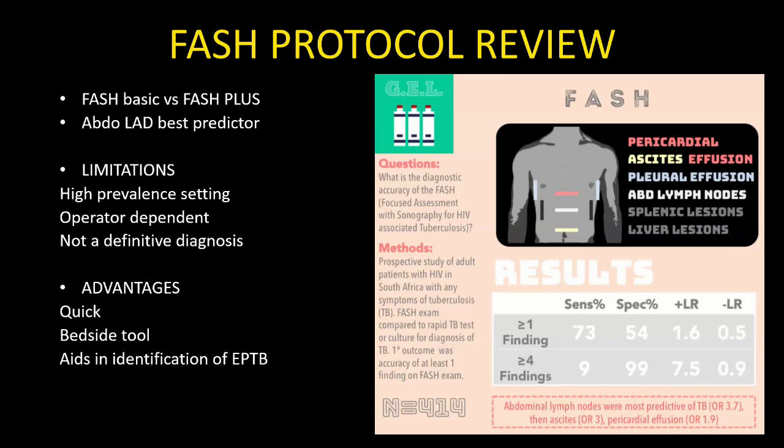And then in the era of ultrasound as a bedside tool, it's relatively easy, it's quick, and it's often very helpful in the diagnosis, especially when patients are smear negative or culture negative. It often will lead to sooner identification and initiation of treatment.